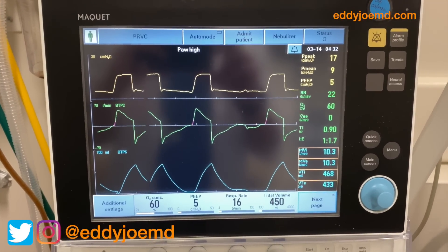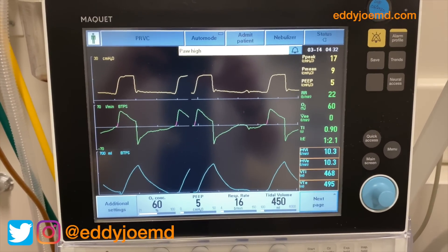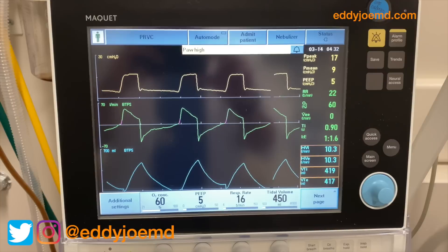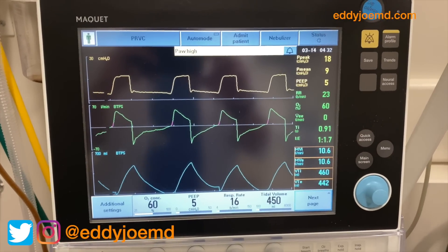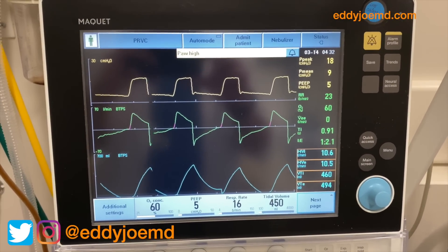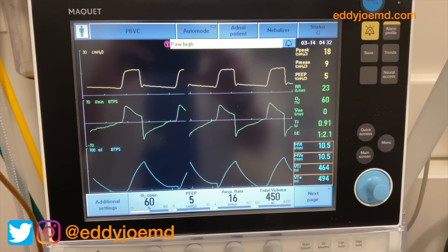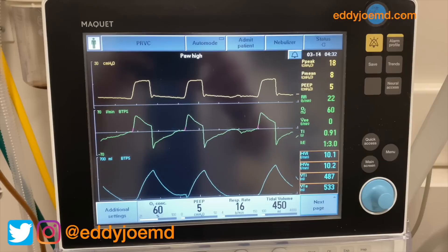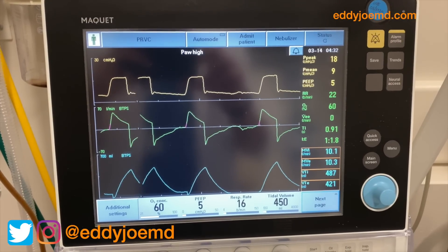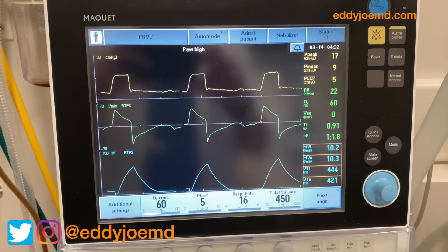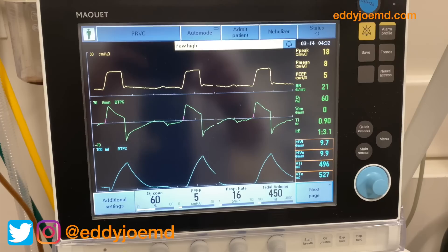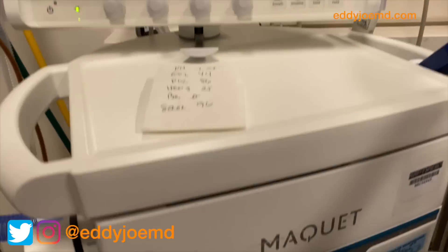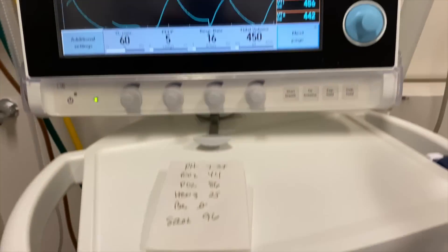All right team, this is a very simple, easy, basic ventilator video that I'm making with the intention of this being for hospital medicine colleagues and other colleagues who are not used to taking care of patients on mechanical ventilation. By no means is it going to be an all-inclusive, all-thorough, all-encompassing video. It's more of a quick and dirty on how to get the job done, and for this I'm using the Servo ventilator.